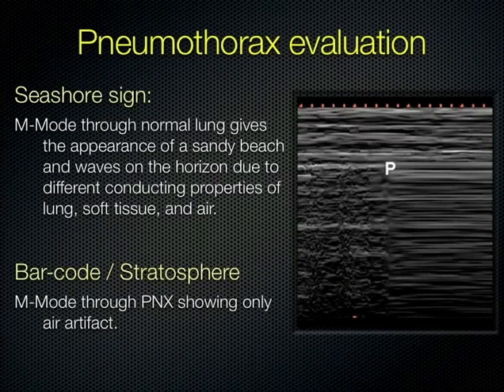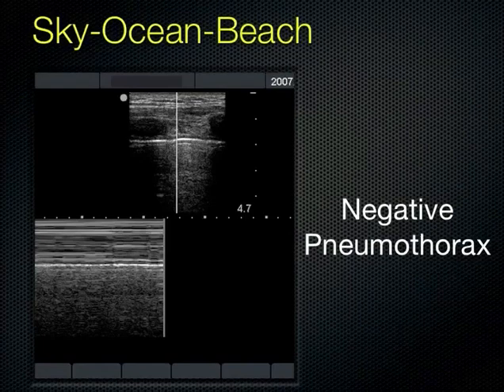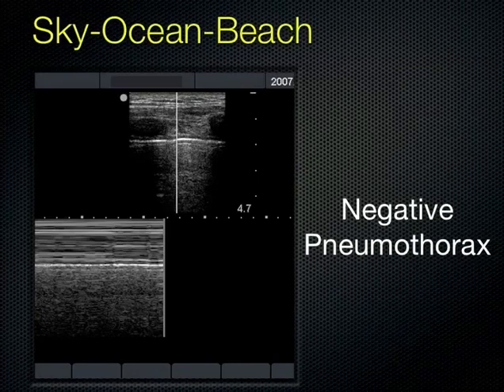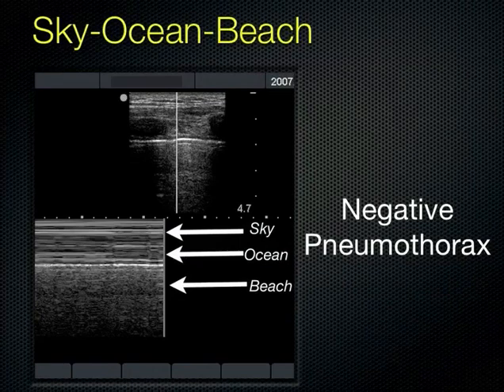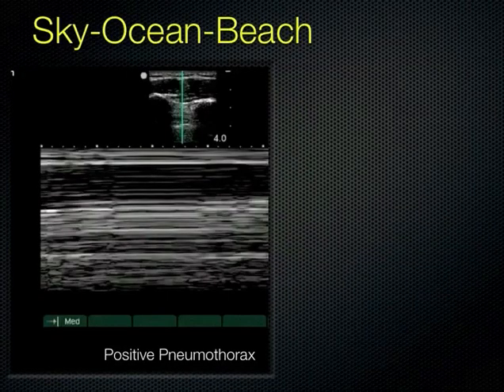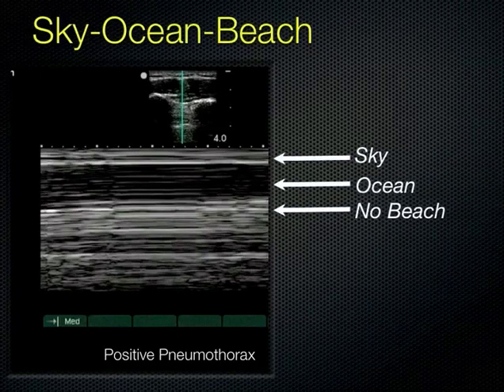Here is an M-mode through the pleural interface showing the sky, then the pleural line as the horizon where ocean meets land, and a grainy beach more inferiorly due to lung motion. By contrast, the other example shows an A-line in the upper picture — could be pneumothorax or normal — but the M-mode shows no beach. That is a pneumothorax, which looks like a barcode. In your models today, if you ask them to hold their breath during M-mode, you'll be able to see the stratosphere or barcode sign, since a non-moving lung won't produce graininess.